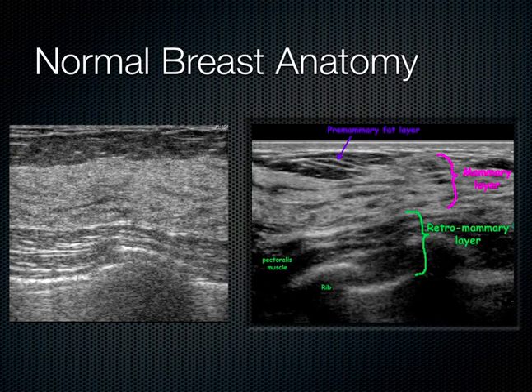Now, the normal breast anatomy is very simple, and like most glandular tissue, it has a very typical layer pattern. So we can see really three main layers here. This is layer number one. Here is the subcutaneous layer. This is just subcutaneous fat here.